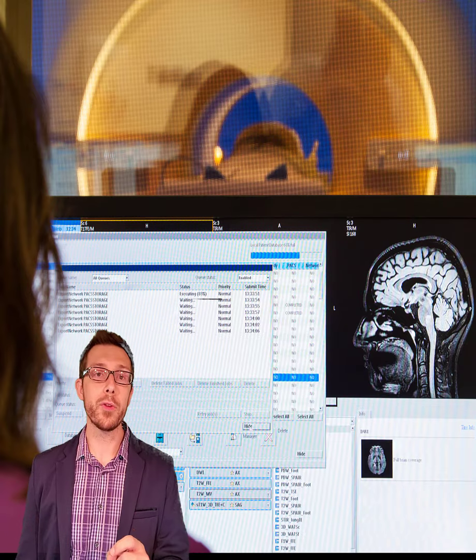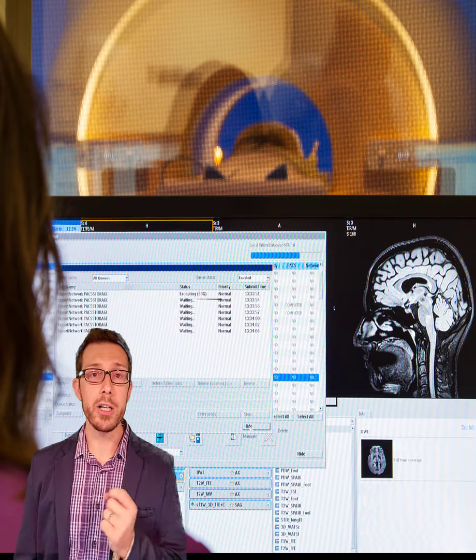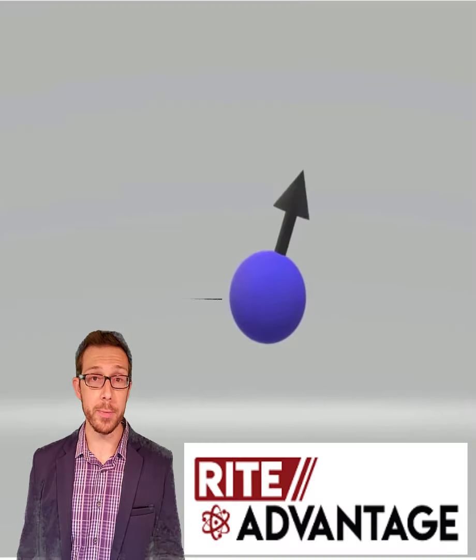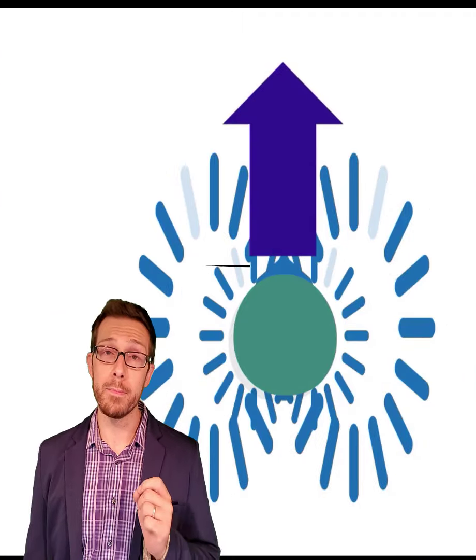There are 3 behaviors of hydrogen. Now, the first one is the spin that we talked about, and that produces angular momentum. Hydrogen's angular momentum is equal to its mass, velocity, and radius. Not only does the spin produce a precessional frequency of hydrogen, which is actually a pseudo frequency, it also gives rise to a magnetic field. We call it a magnetic moment.